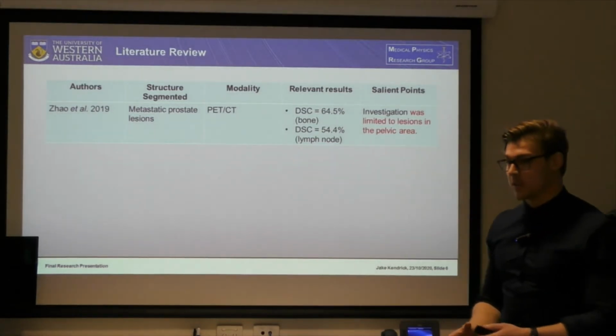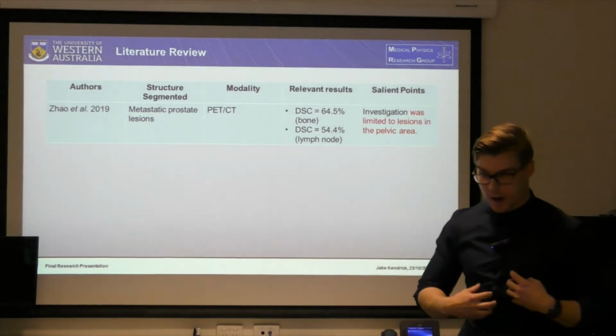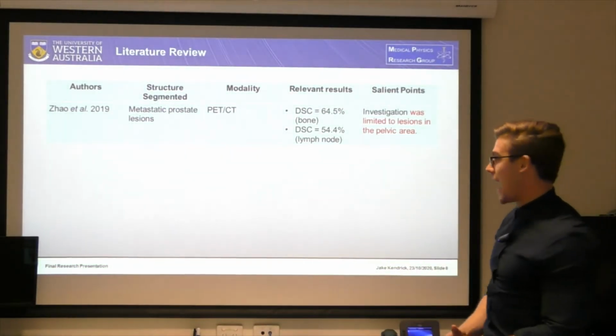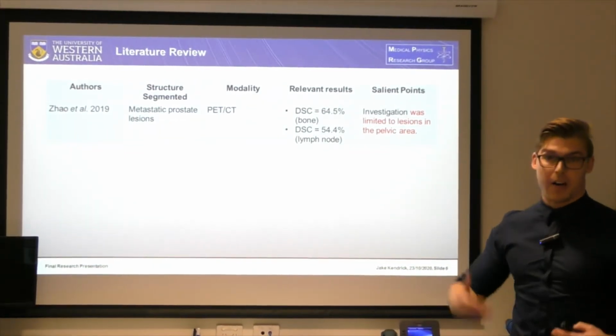But the most important to recognize here is that their investigation was only limited to lesions within the pelvic region. So a primary aim of this project is to extend upon their analysis and attempt the automated segmentation for whole body PSMA scans. And whole body is just defined as middle of the thigh to head.